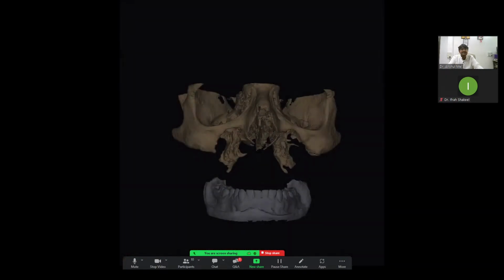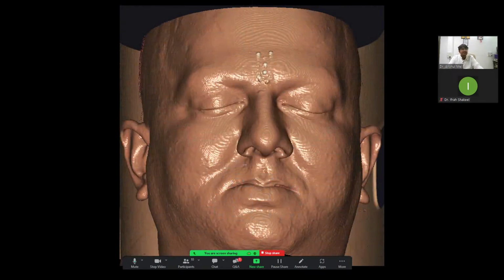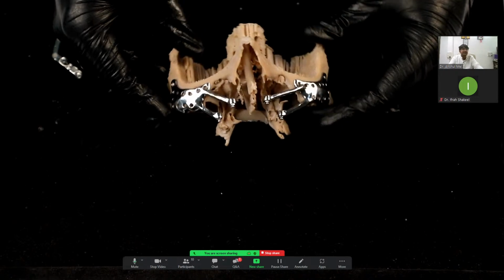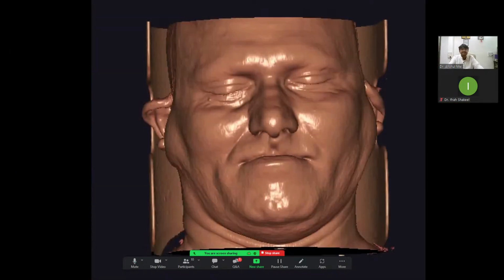In the case of maxillectomy, with right and left customized implants with the Equator abutment, the bar is ready before surgery, and the prosthetic. On the day of surgery, open the flap, place the implant on the right side and left side, place the bar, but don't fix the implant to the bone. After fixing the prosthetic, fix the implant to the bone, so they have a reference. After fixation you open the bar, close the flap and reinsert the prosthetic. There are a lot of publications of ours on it; you can go through them in oral and maxillofacial journals.